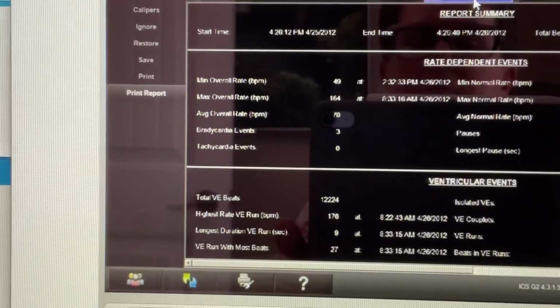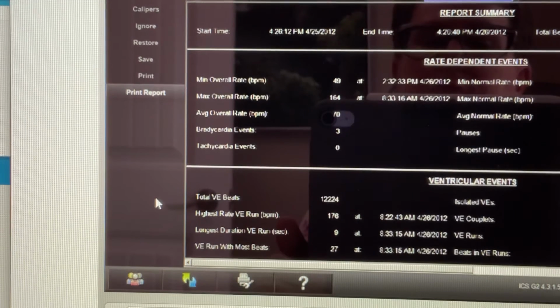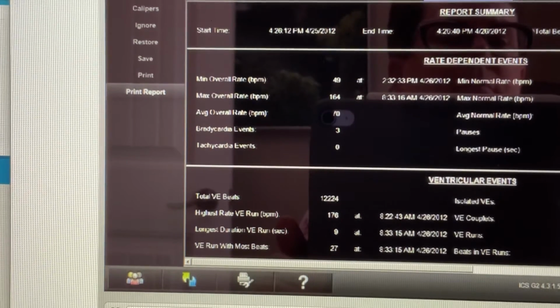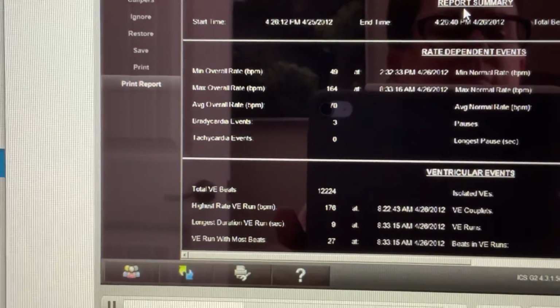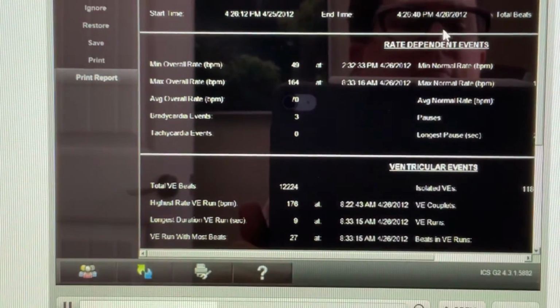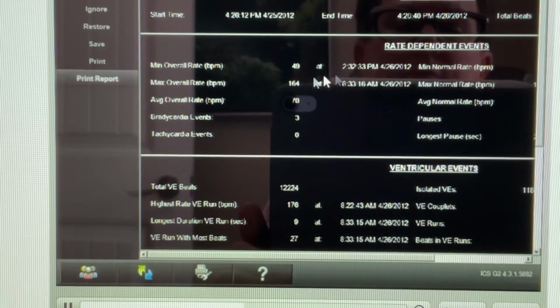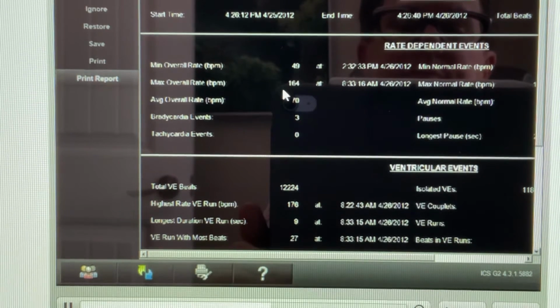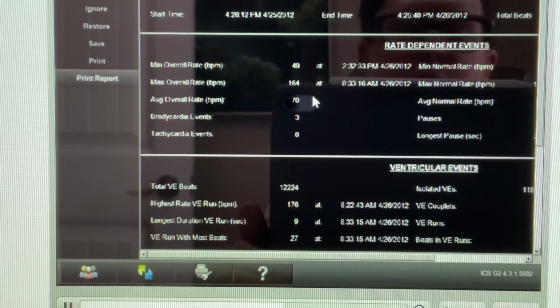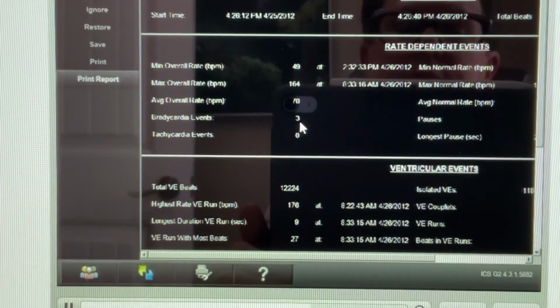This report can be used for documentation purposes as a shift report, as a transfer report, or as a discharge report when the patient is moved from one department to another. It can also be used as a discharge report when a patient is sent home from the emergency department or from any other unit. All events are hyperlinked and provide a numeric notification of the number of instances that a particular type of event has occurred.